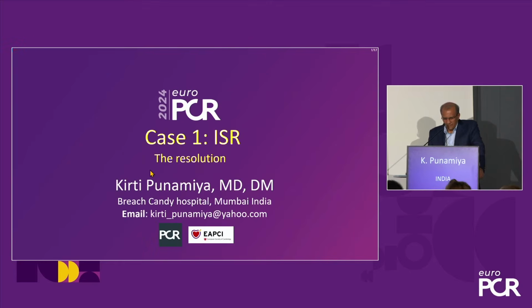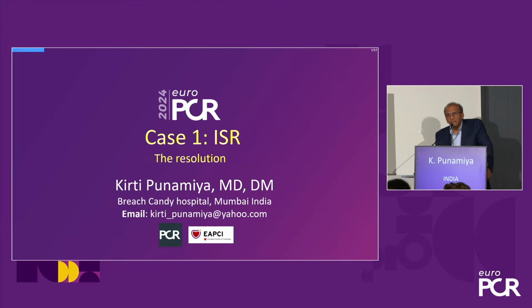Thank you very much. Question and comment together. First of all, we cannot see the distal vessel. So is there any CTO there? If you use rotational atherectomy or crown atherectomy, which is probably less aggressive, you cannot go through the distal vessel, because I saw that the wire couldn't cross the distal vessel. So whatever you have to do, I think you have to do it till the last stent where you see flow. Afterwards, it's debatable what you should do.